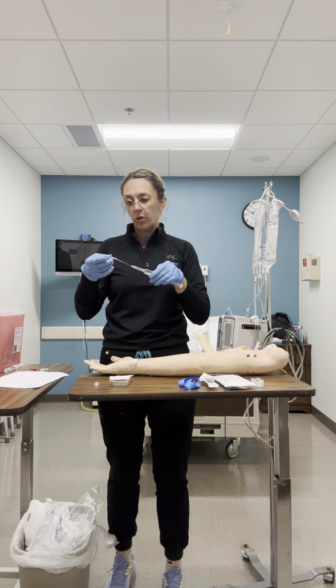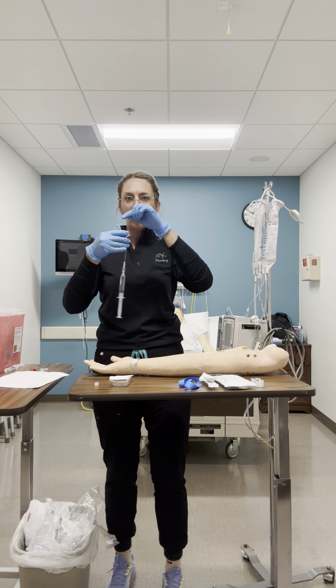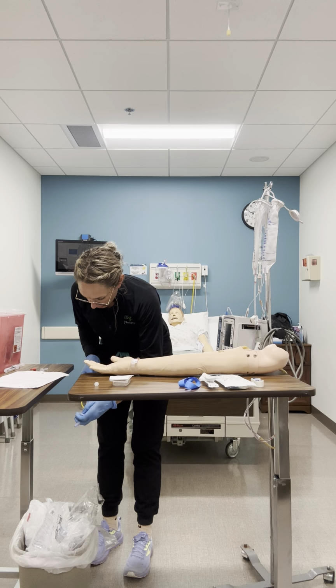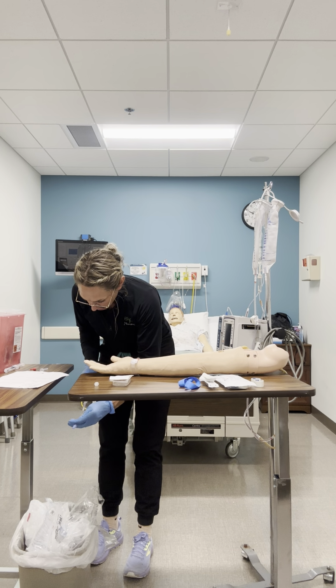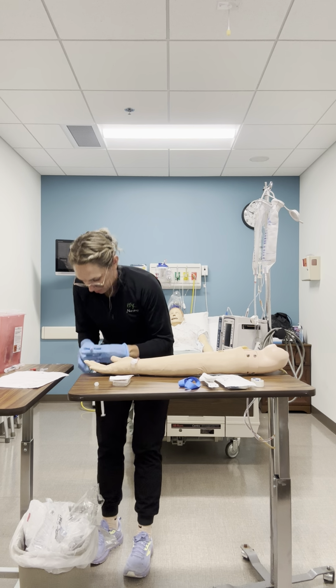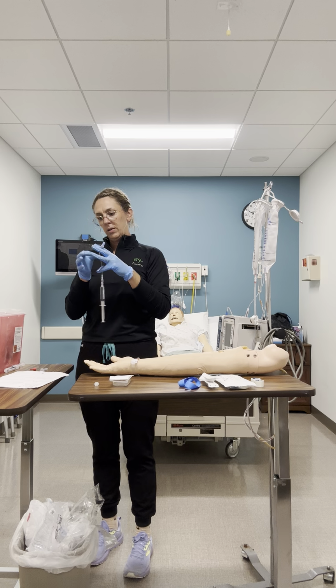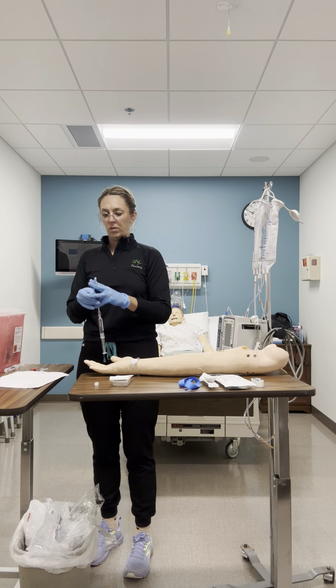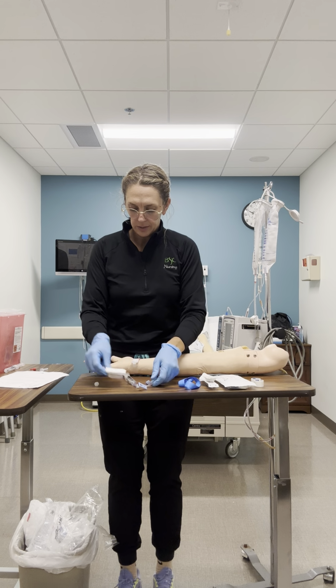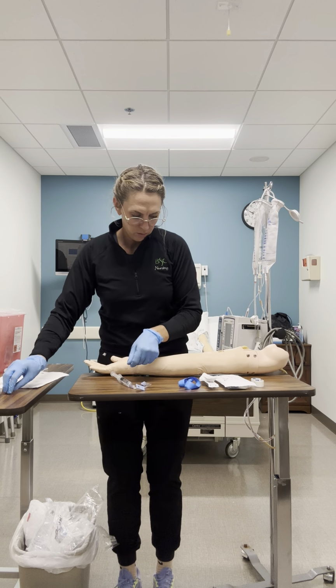And I'm just gonna make sure that it's primed. So I'm bringing saline all the way through. I'm gonna open the clamp. I'm gonna push enough saline through to make sure it's primed. It is primed. We don't wanna waste. We want to make sure there's no bubbles. No bubbles. We're gonna clamp it. And that gets set aside with that.